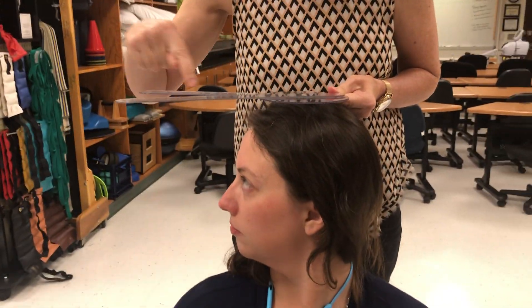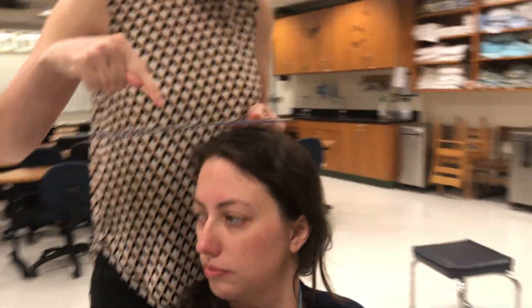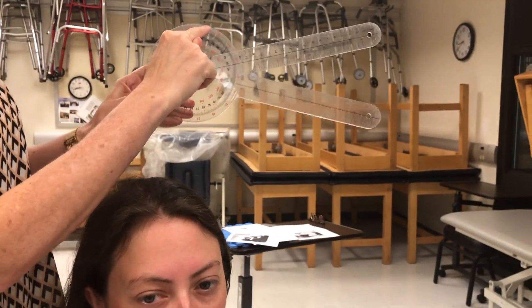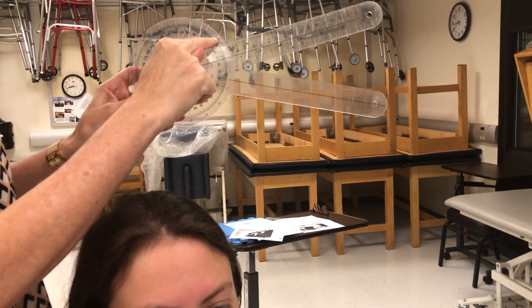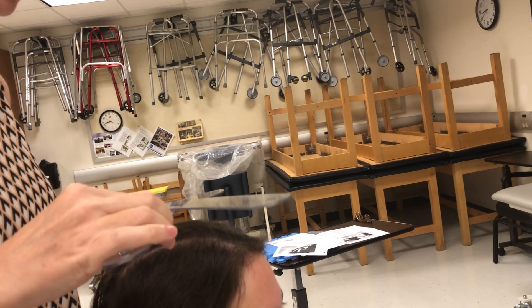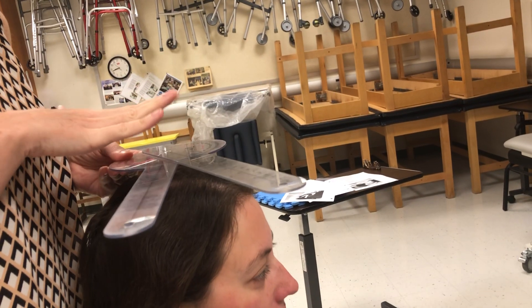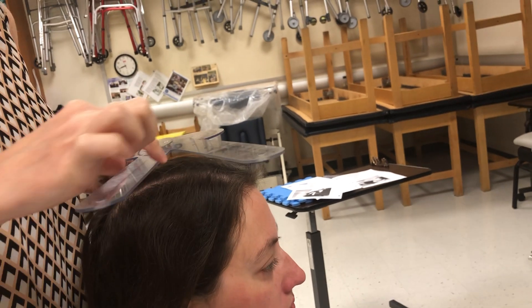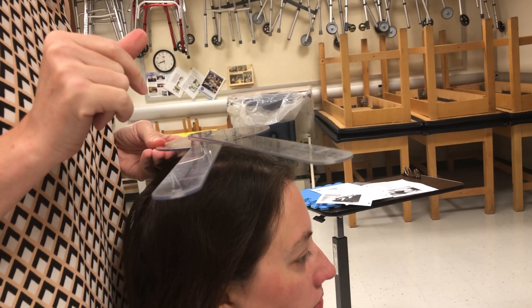I bring the moving arm over so that it is in line with the tip of her nose. Because she started at zero, reading the red numbers, she's at 65 for right rotation. I can keep my goniometer set up just like this in order to do left rotation — I can still keep the stationary arm over her right shoulder, it doesn't need to switch.